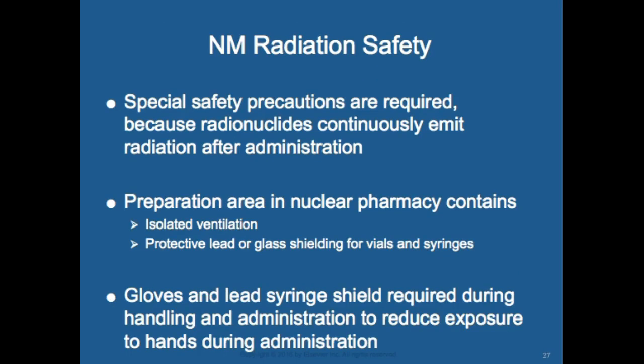So when we talk about nuclear medicine, safety is really big. Special safety precautions are required because radionuclides continuously emit radiation after administration. So having the area prepped in nuclear medicine is really big. You have your own isolated ventilation. You have to wear protective lead or glass shielding for vials and syringes, and gloves and lead syringe shields are required during handling and administration to reduce exposure to the hands during administration to the patient.